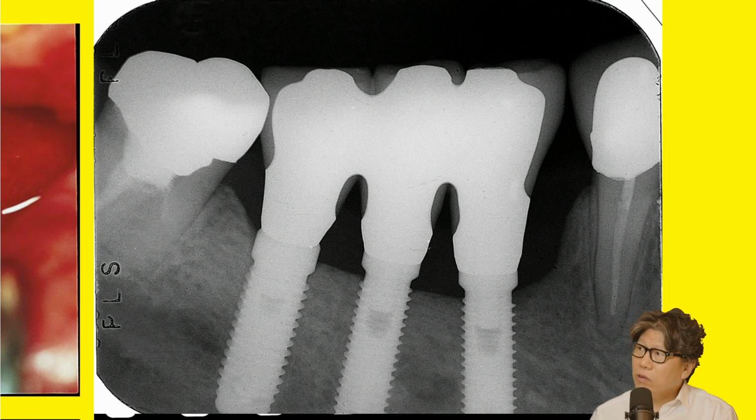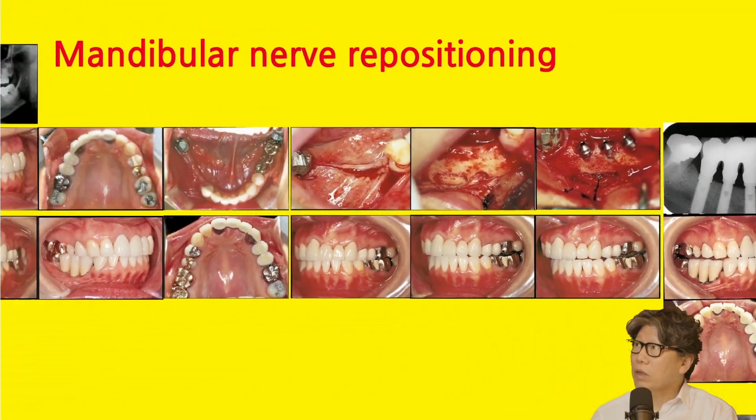I think I used a stereos implant here then. I took out the one behind the long one and put in the long one, and this patient was followed up for like 20 years. I don't know what's going on now, but she lived far away. So I was doing follow-ups, and then at some point she stopped coming in. I think something happened. This is a stereos implant, and I think this was a good one. It's got a stronger abutment connection, so I think it lasted a little bit longer.